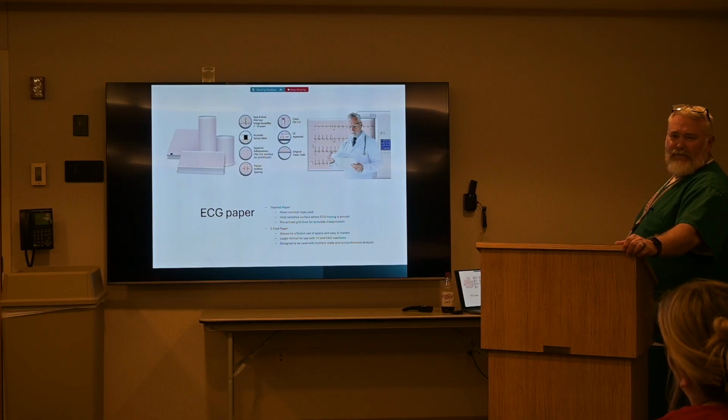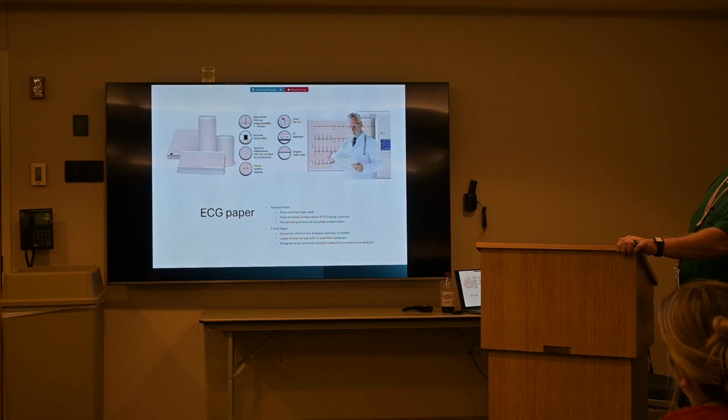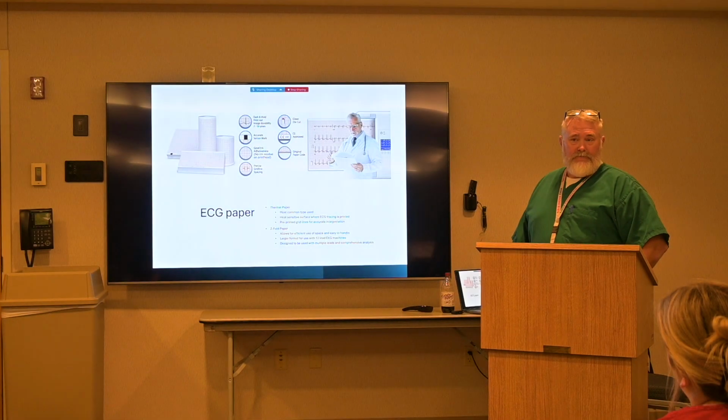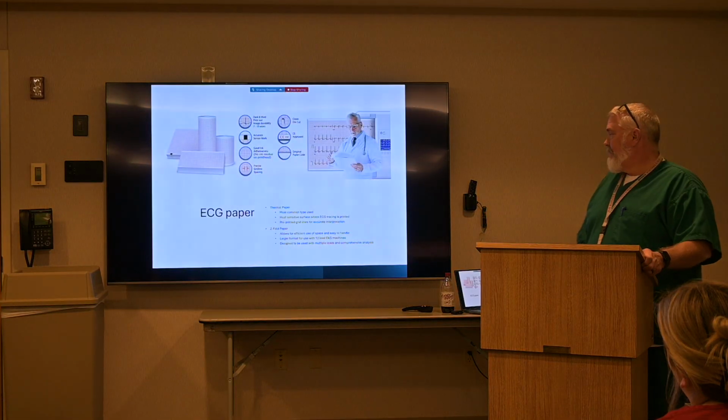I don't know, is ours Z-folded, or does ours come in rolls in our system? Yeah, I think in the ER they're folded. The Zoll machines are Z-fold. I don't know about the others. The others are rolls, I guess. Rolls, honestly. Yeah.